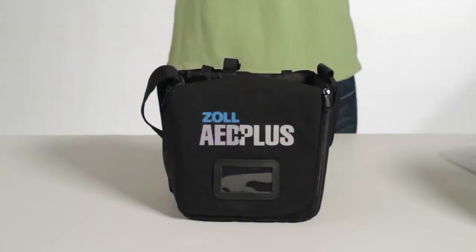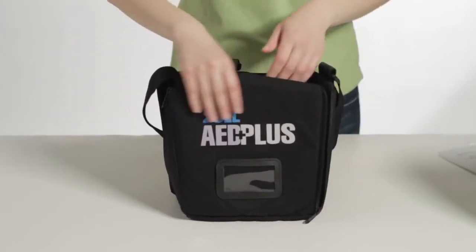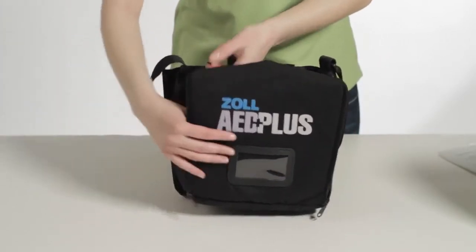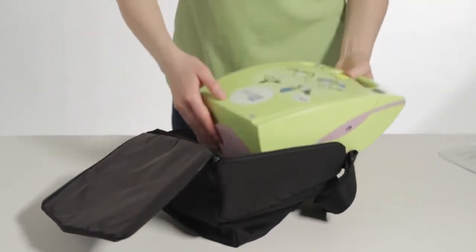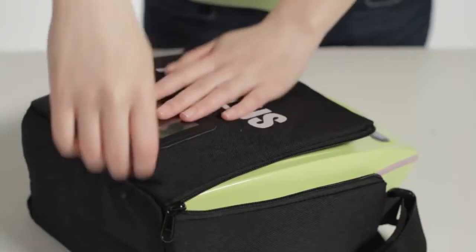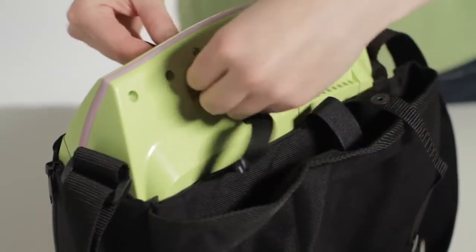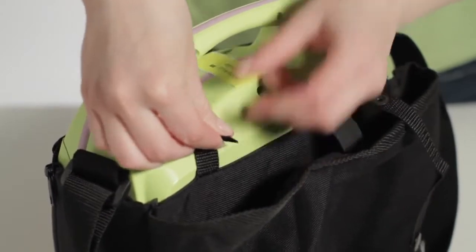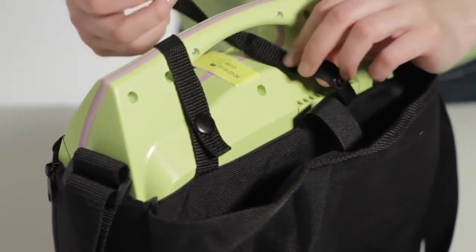If you don't keep your AED Plus on a wall bracket or in a wall cabinet, or if you travel with it, you will probably want to keep it in the soft pack carrying case. To secure it in the carrying case, zip open the cover and place the AED Plus into the top pocket. Zip the cover closed and snap the two handle retaining straps closed to completely secure your AED Plus in its carrying case.